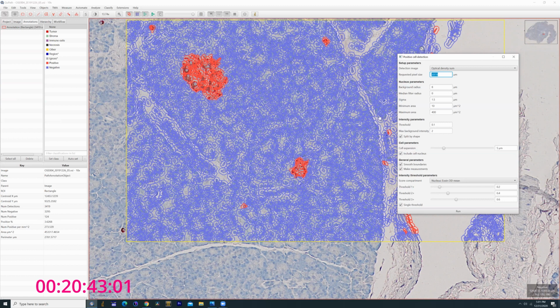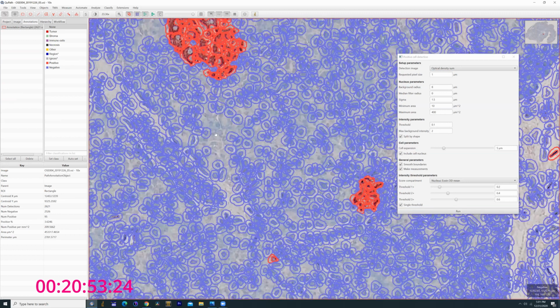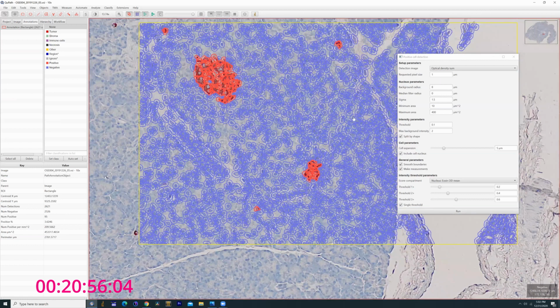So generally, for time's sake, I set this to 1, and you'll see why as we move through this. But basically, you're more likely to pick up some of these micro features with a higher resolution image instead of downscaling first. But it's also going to strangle your machine later on as we move forward.